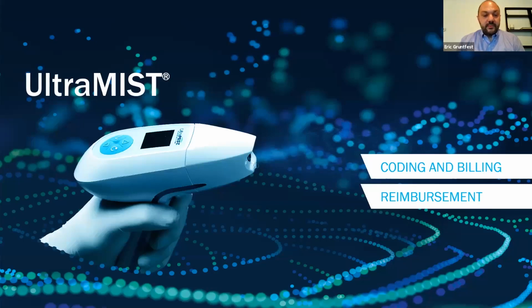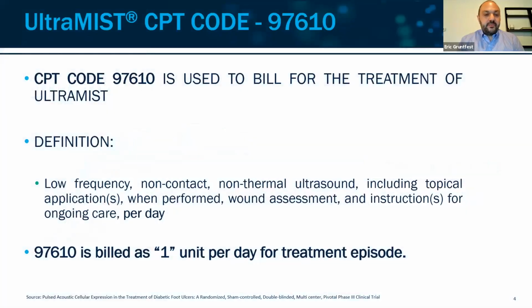We'll start today with the reimbursement, coding, and billing for UltraMIST. If you are familiar with UltraMIST, it is a machine used for ultrasonic treatment of wounds. The CPT code for UltraMIST is 97610. That is the procedure code used to bill for the treatment of UltraMIST. The definition for 97610 is low frequency, non-contact, non-thermal ultrasound, which includes topical applications when performed with wound assessment and instructions for ongoing care per day. That being said, 97610 is billed as 1 unit per day for the treatment episode.